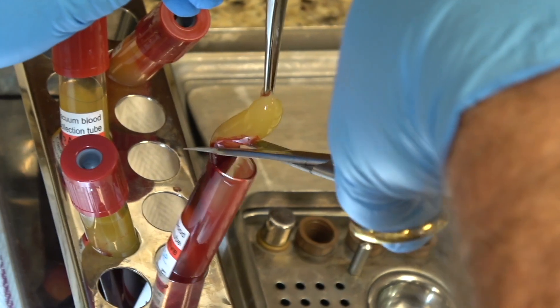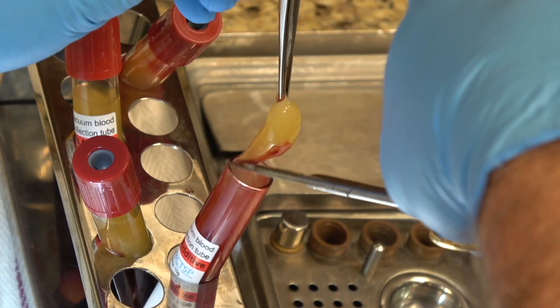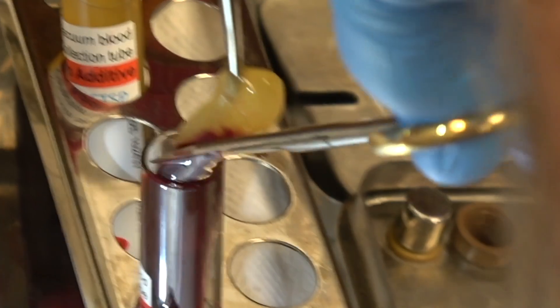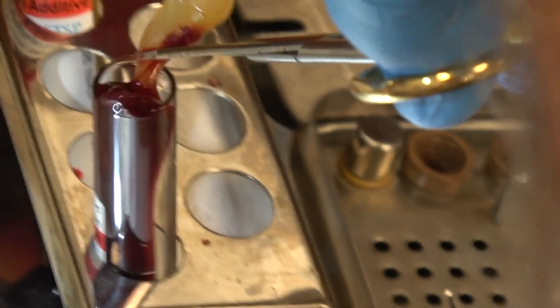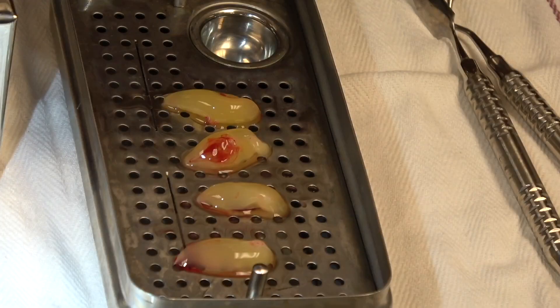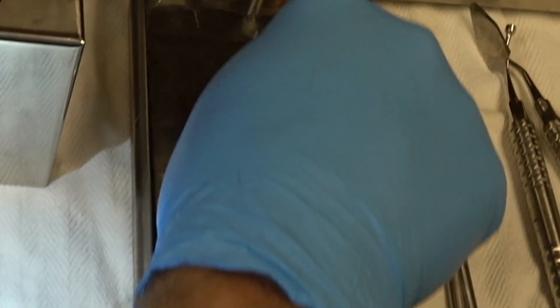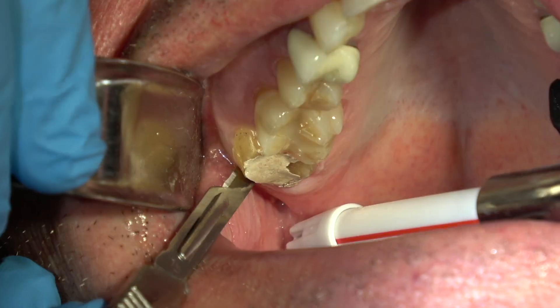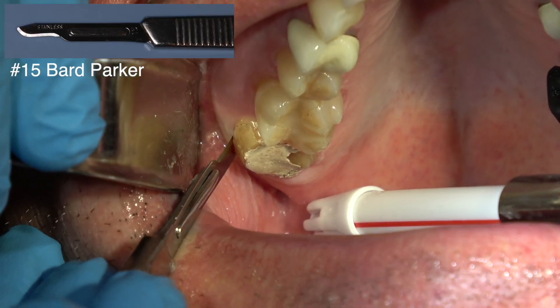This is the PRF — the yellow part — and I'm not going to go into how we make that; you can refer to the link. But we use this a lot in our surgical cases. You place it on this perforated tray and then put the lid on top of it, and it squeezes the serum from the PRF clots, which goes into the tray below the perforated section.